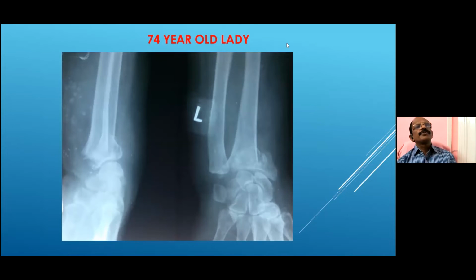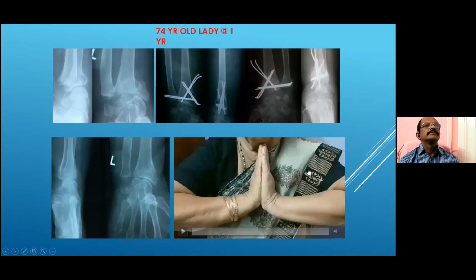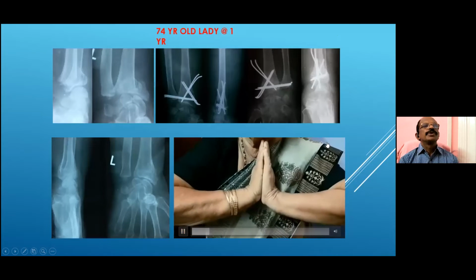This is a 74-year-old lady with a severely comminuted, intra-articular fracture. You can see this fracture. And the same lady, pre-op, post-op, and also X-ray at 1 year, and also her range of movement at 1 year.